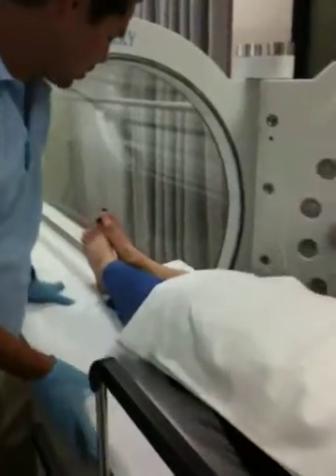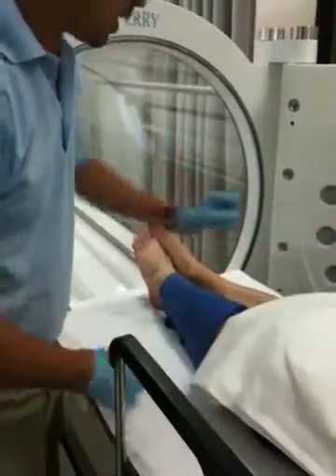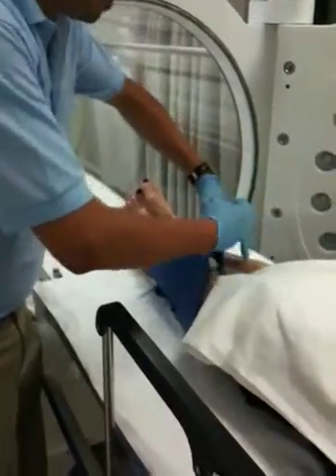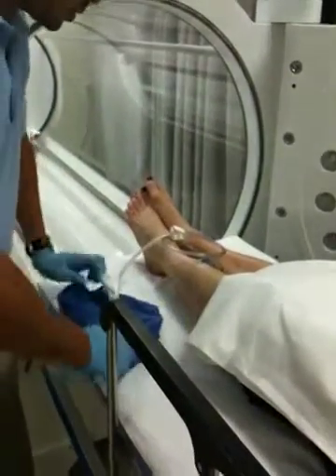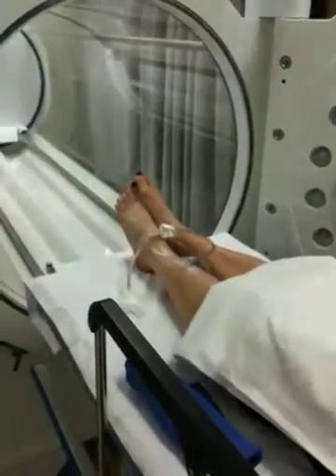Now that the patient is coming out of the chamber, we need to reconnect the KCI wound vac. So what we're going to do is remove the moist pillowcase or towel, whatever you have, and get the wound vac over here.